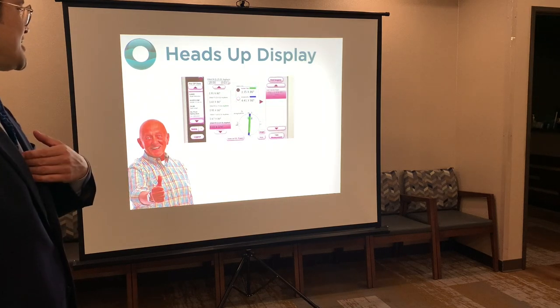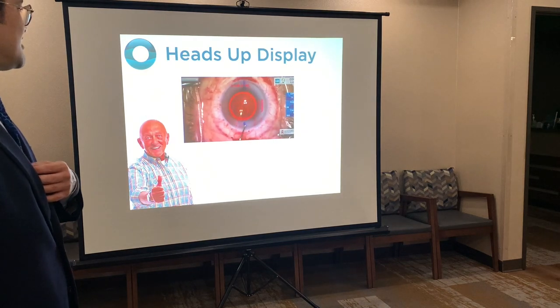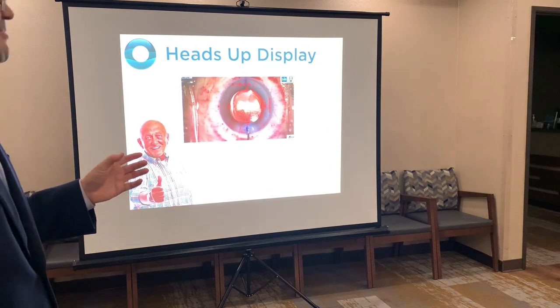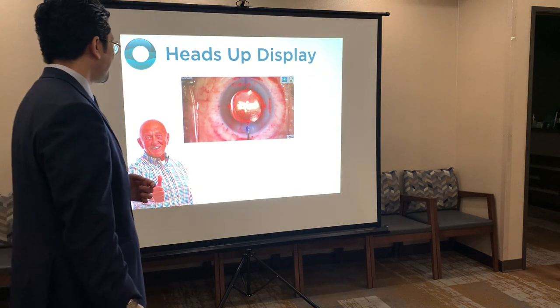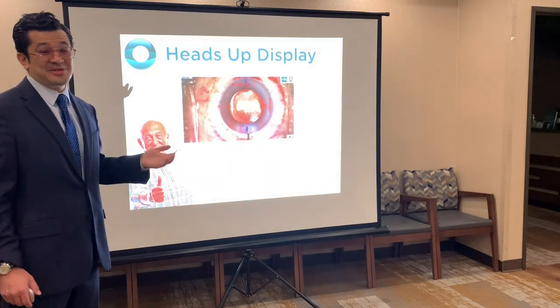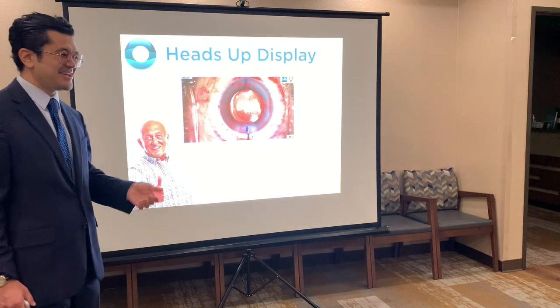But if you're me sitting at the microscope, you're gonna see this. You're gonna see that heads up display. It's actually tracking the pupil. It's actually measuring the astigmatism real time. So really neat to have that technology. And now that we've been using it for so many years, I always wonder how we did it before this, 7 years ago.